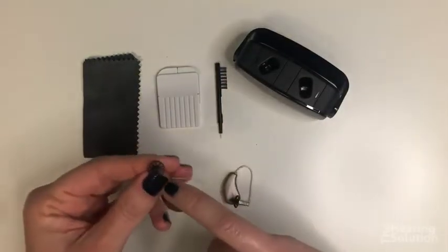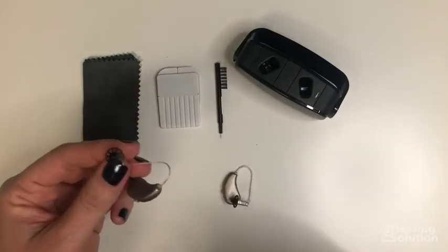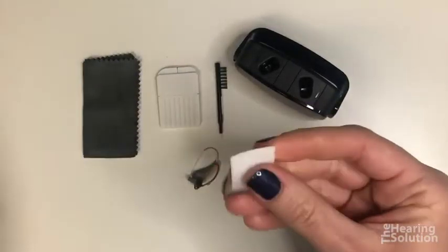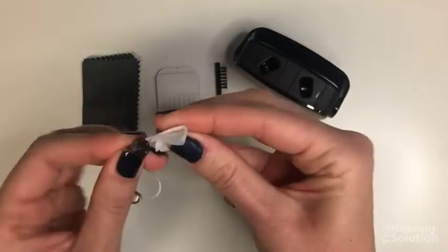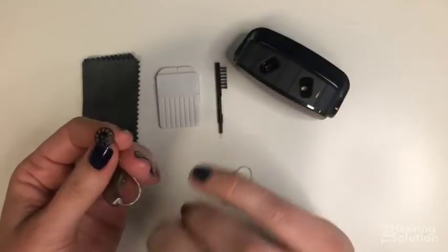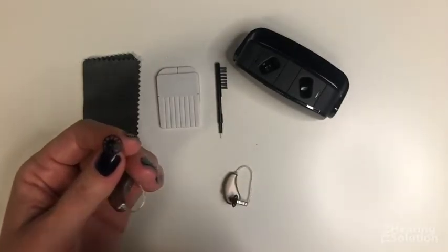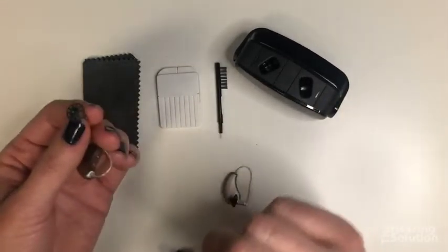The first step is to clean the tip that goes in your ear — this rubber part we call the dome. You can just wipe it down and be pretty rough with it; you won't hurt it. Your provider should give you extra domes in case one starts to look worn, gets ripped, or goes missing.